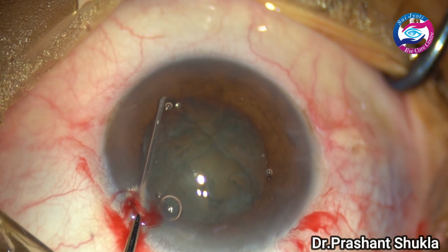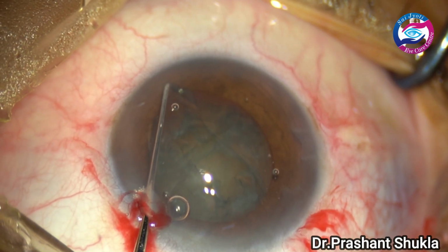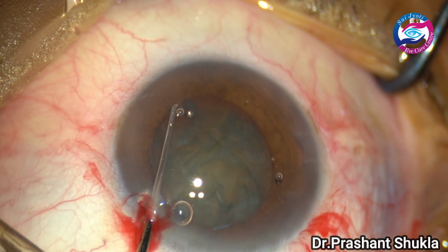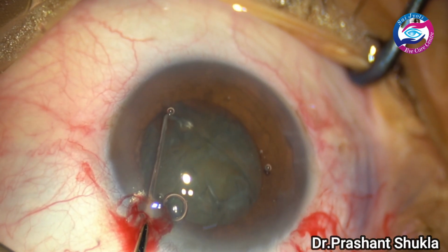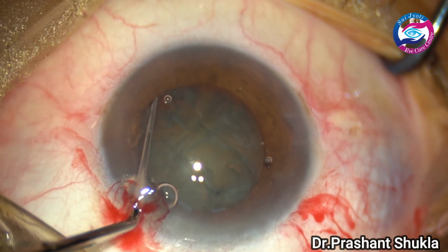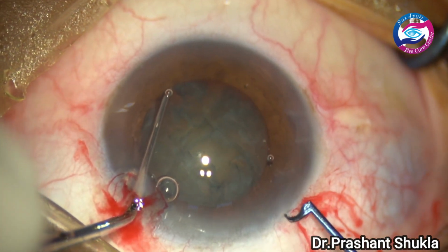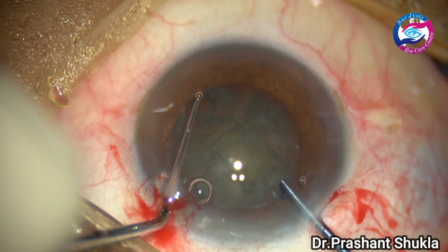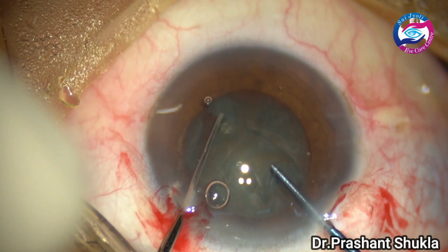Here I am using a nucleus sustainer. It's a ball tip instrument. The edge of the rhexis margin is confirmed by just lifting the iris. The sustainer is gradually slipped below the rhexis margin, and the pre-chopper is being used from the main port.